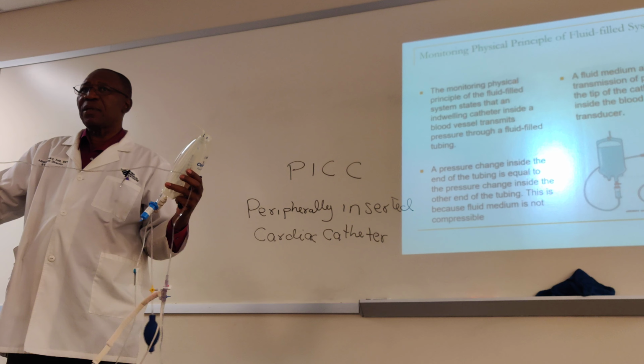Okay? So let's go over the learning objectives. You'll be able to understand the principle of the fluid filled monitoring system, how it works.